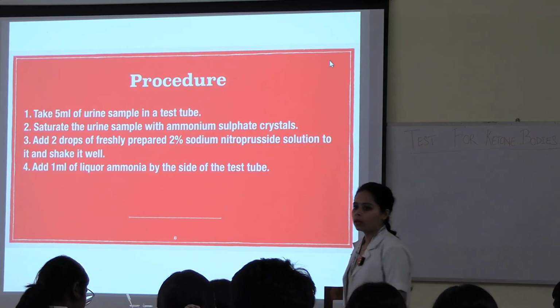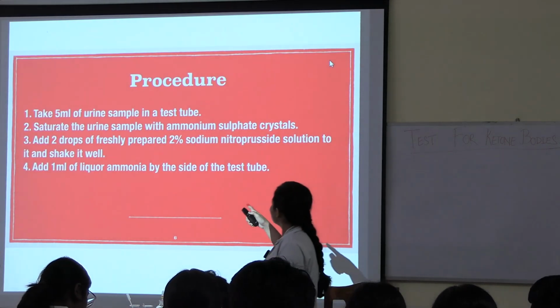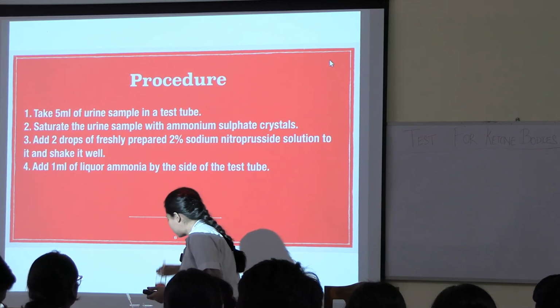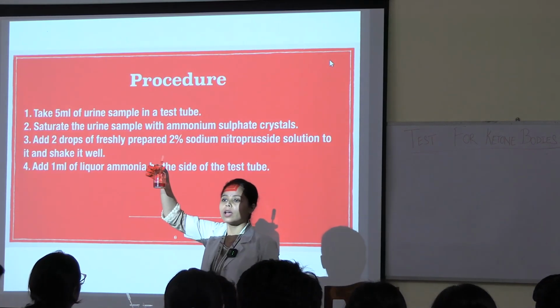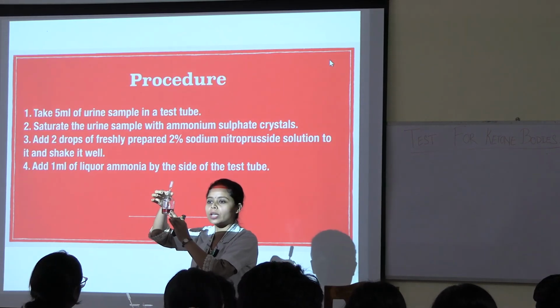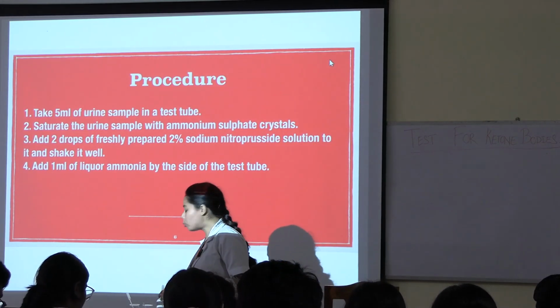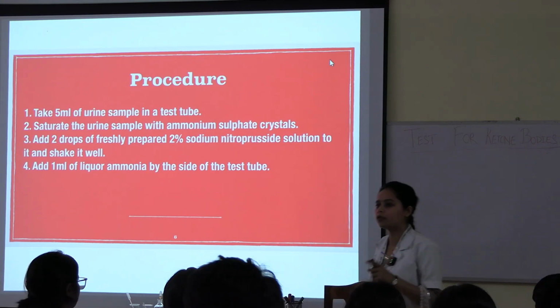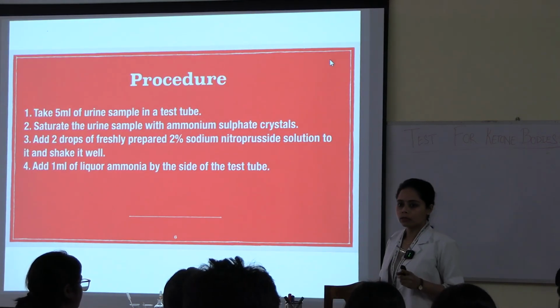What is freshly prepared solution? Freshly, which one? This one. You don't have to prepare it. You have to take 2 drops of this 2% sodium nitroprusside. You don't have to prepare it. Everything is there. You just have to perform the test. Okay?